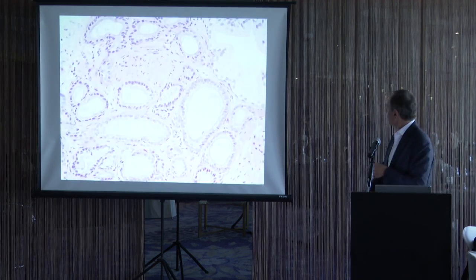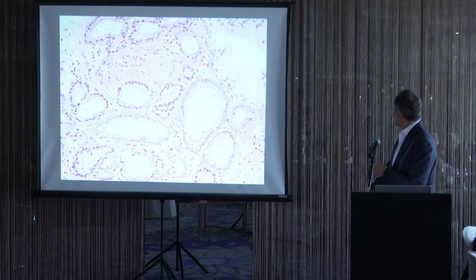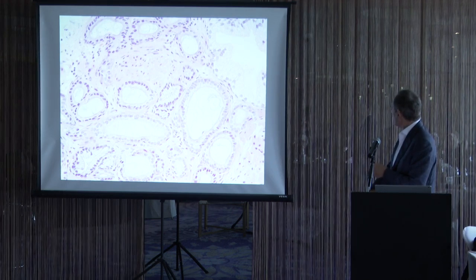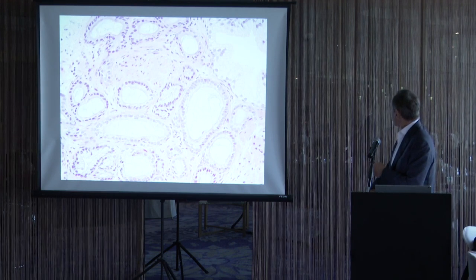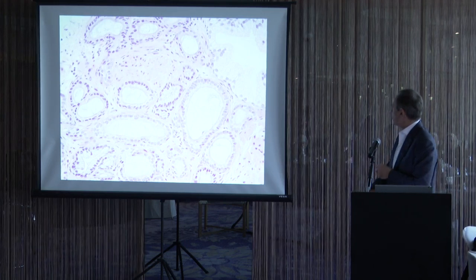Another case where, again, our benign gland is up here in the upper right. You can see that these glands have more amphophilic cytoplasm. Another feature favoring cancer is a sharp, straight luminal border, whereas benign glands tend to have this ruffling of the luminal border. We also see blue-tinged mucinous secretions, which strongly favors carcinoma.